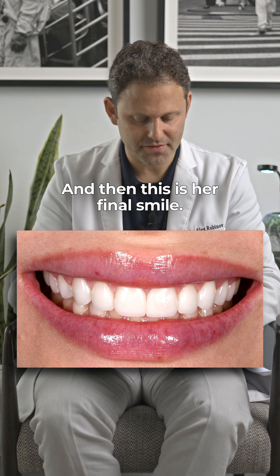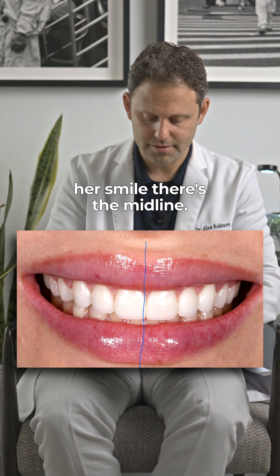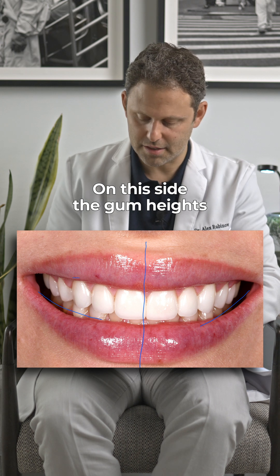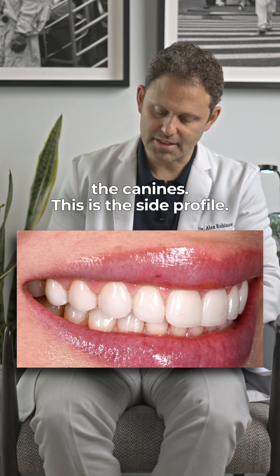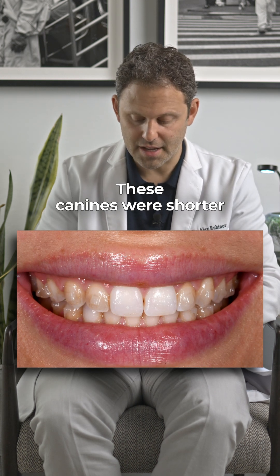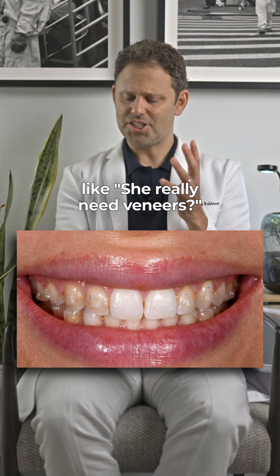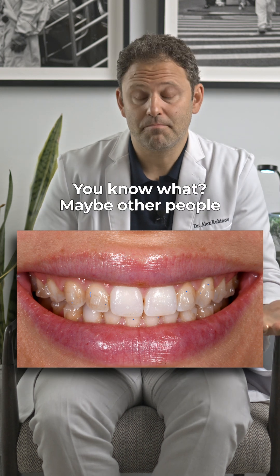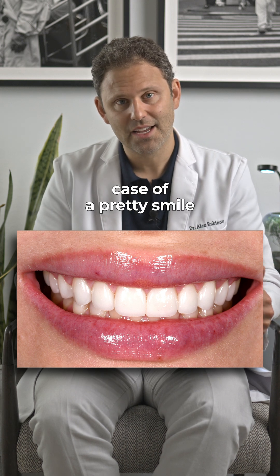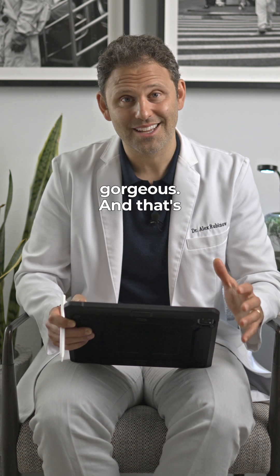And this is her final smile. These are veneers. If we look at her smile, there's the midline, the smile going on this side and on this side, the gum height, the canines. This is the side profile. This is where we started — the canines were shorter, the laterals were different shapes, the centrals were different. You look at this case and you're like, do you really need veneers? Maybe other people would have been done with Invisalign and they're happy. But I knew I could take that case of a pretty smile with beautiful lips and make you look gorgeous. And that's exactly what we did here.